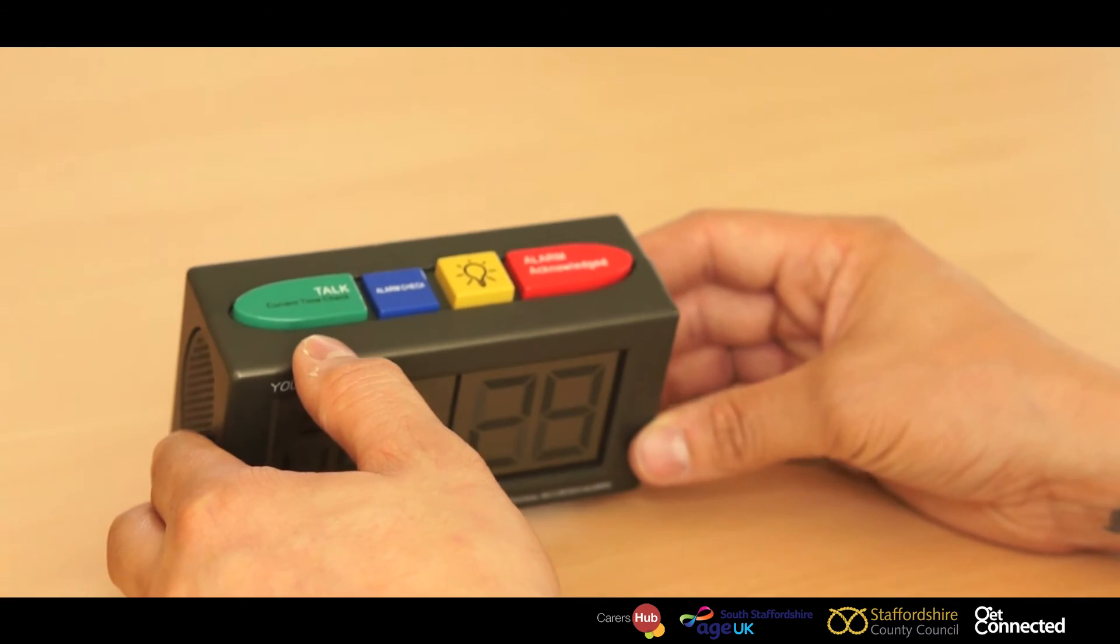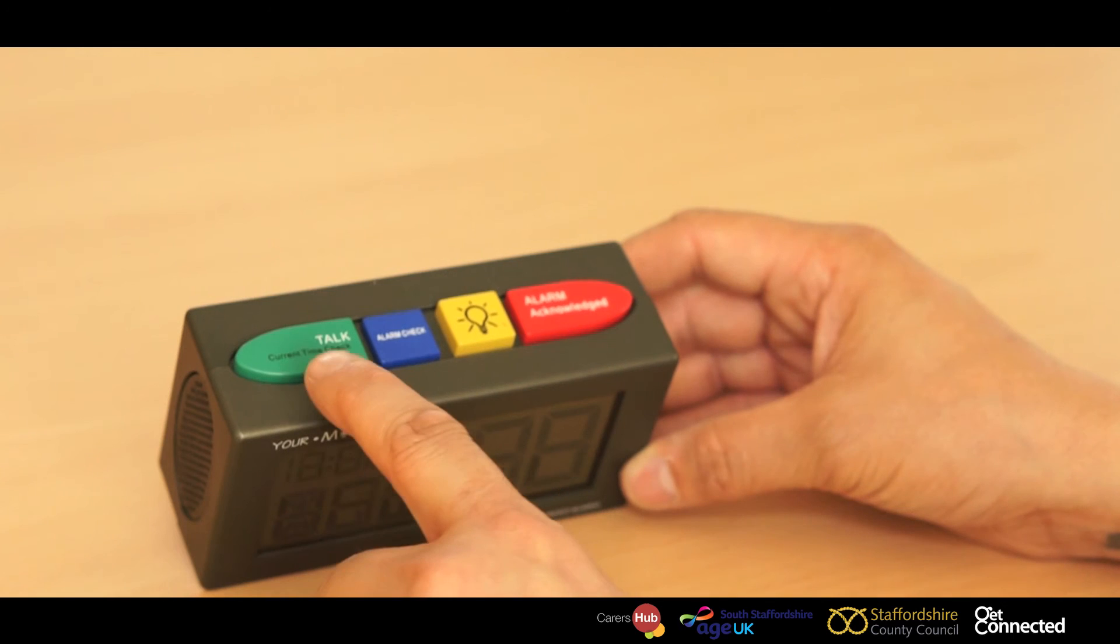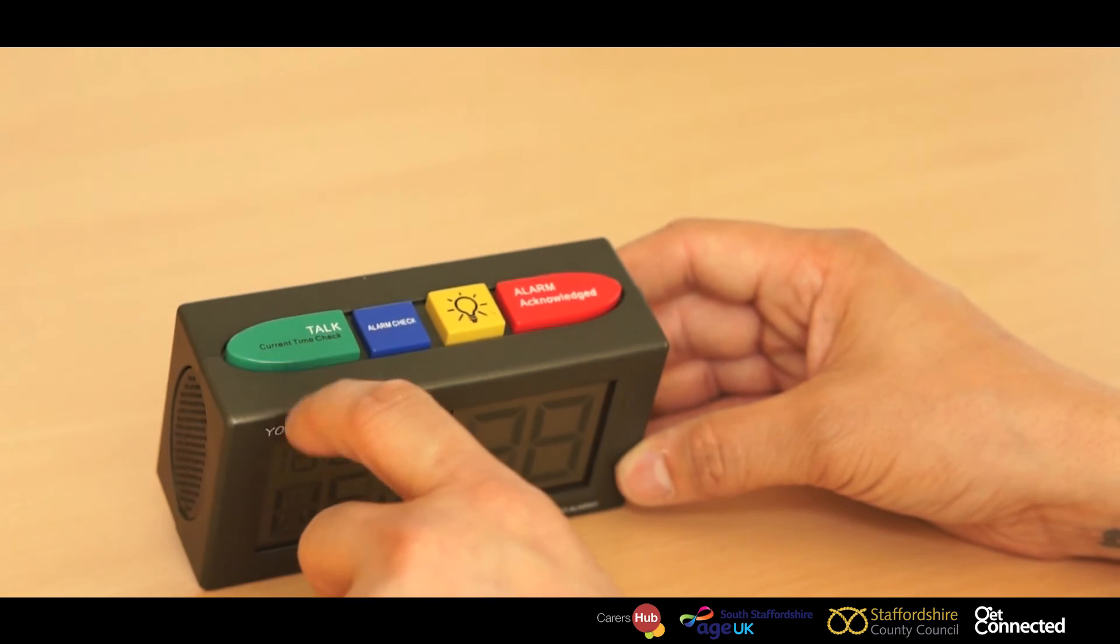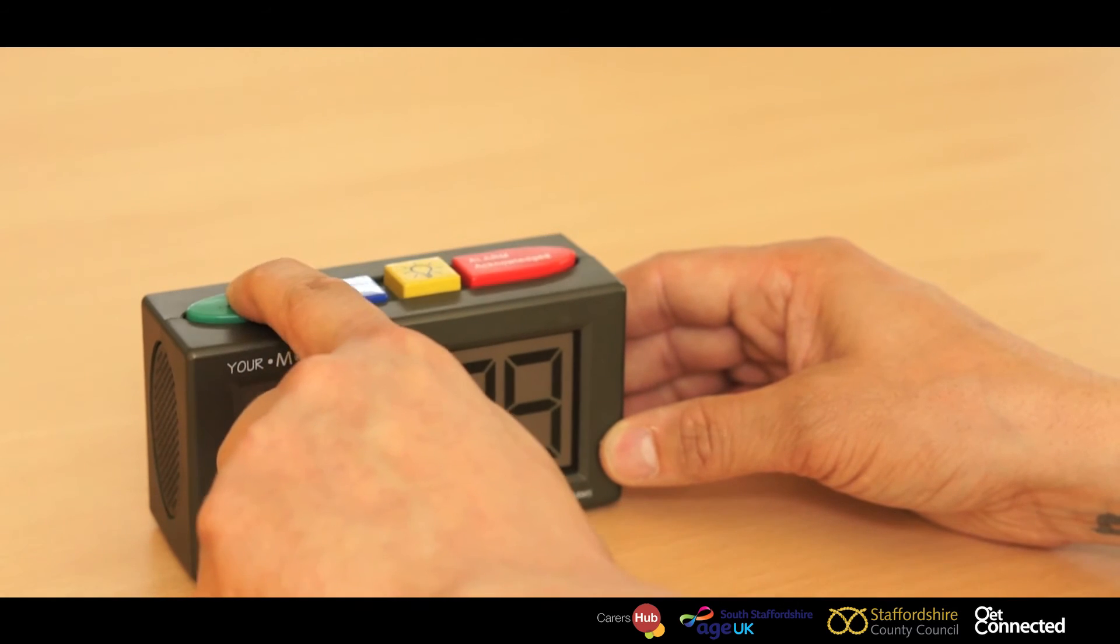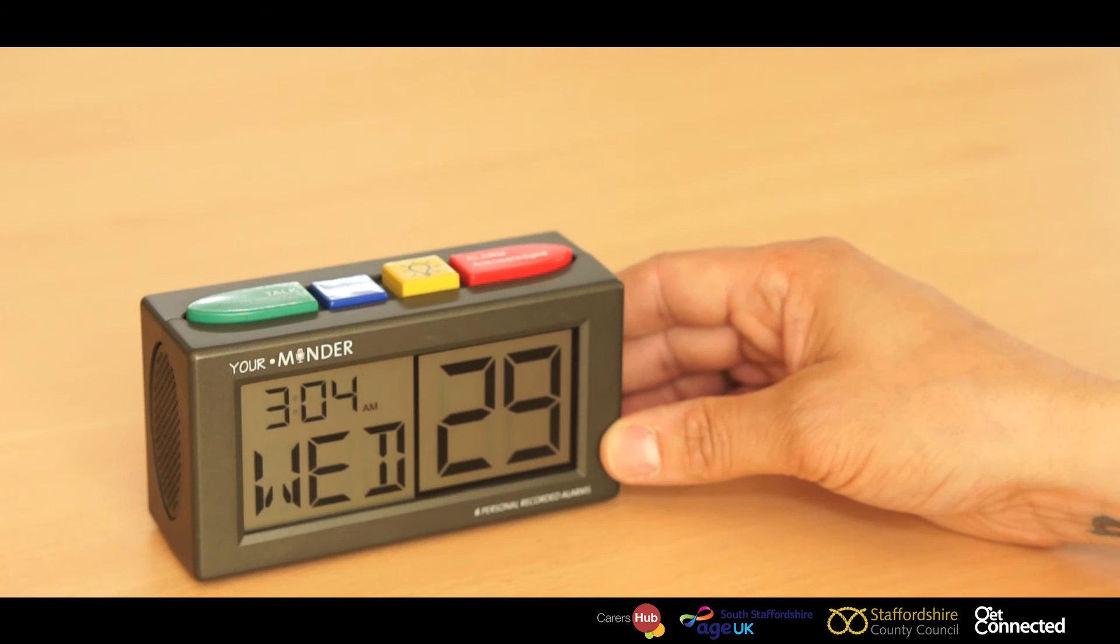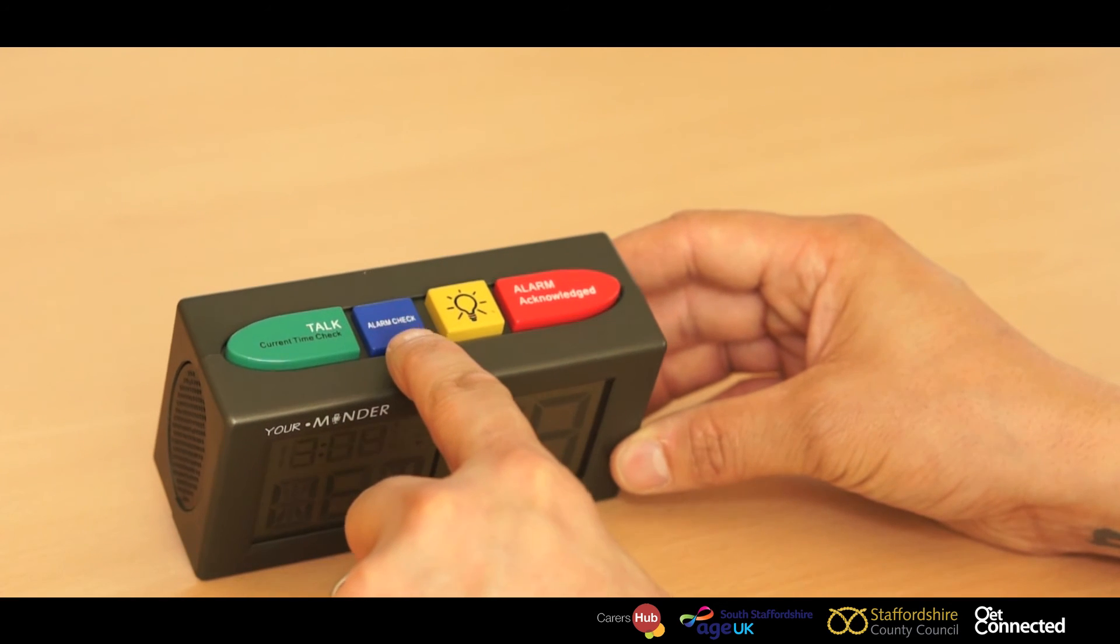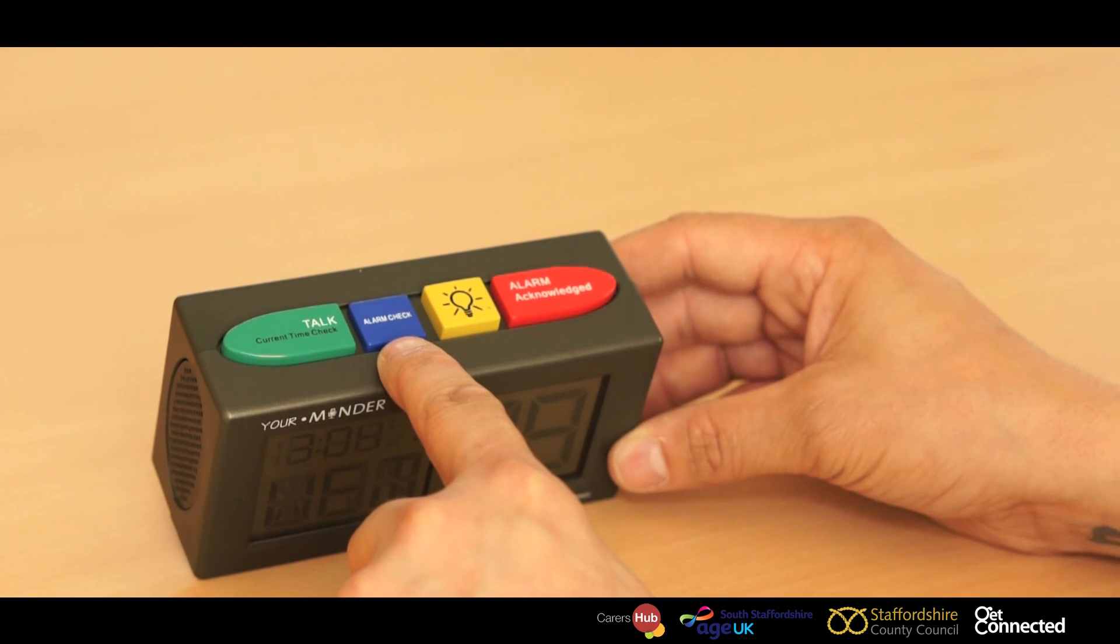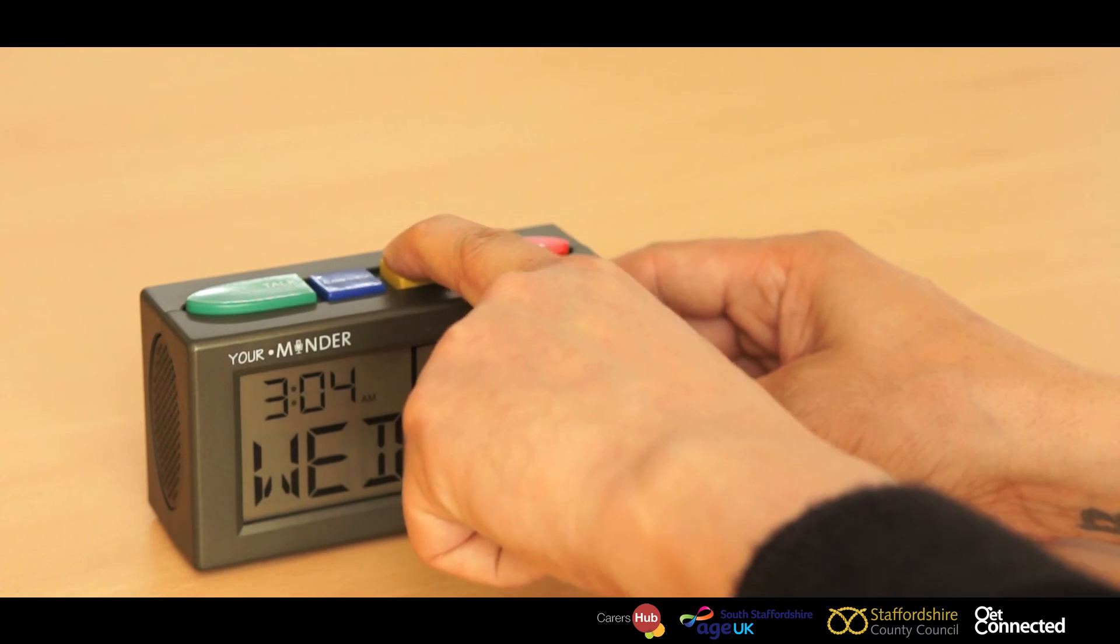On the your minder, there are also other features on here. There's a talk button. This will tell you the date and time for people who are visually impaired. There's also a check alarm. This will check any pre-alarms that are set. There's also a light for if it's dark.